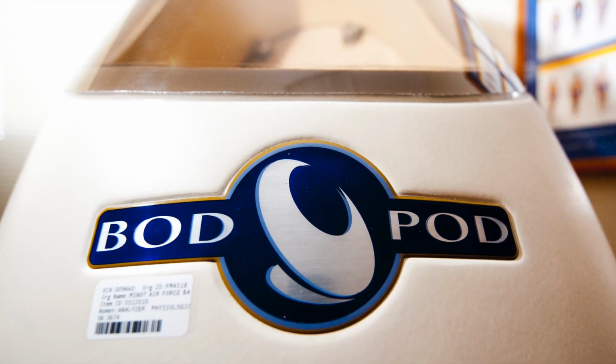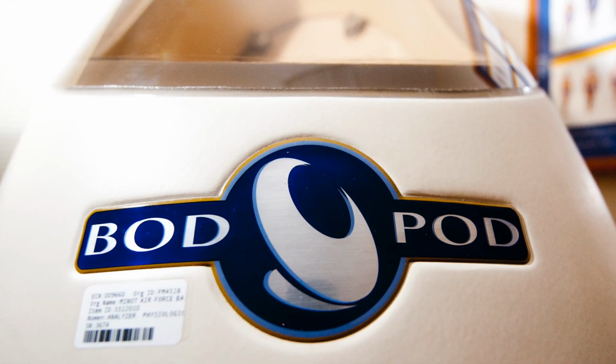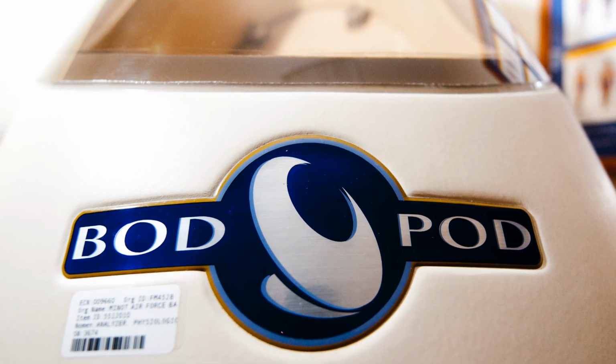Nevertheless, air displacement plethysmography in the form of the BodPod is considered to be the current gold standard of body composition measurement.